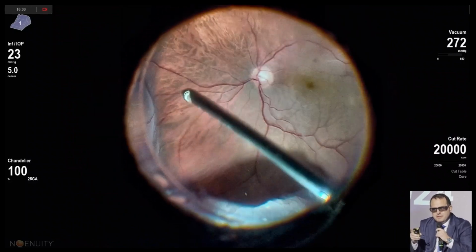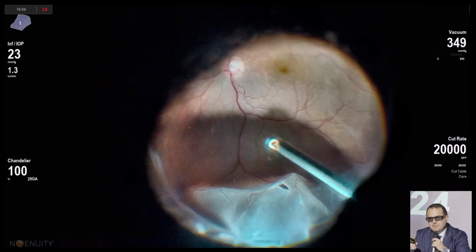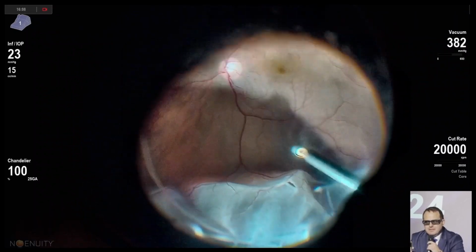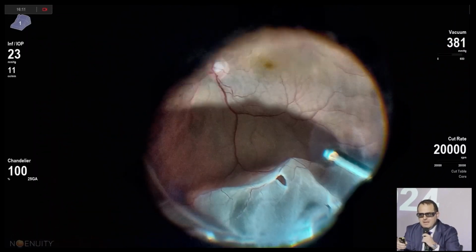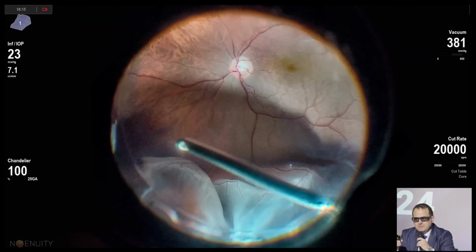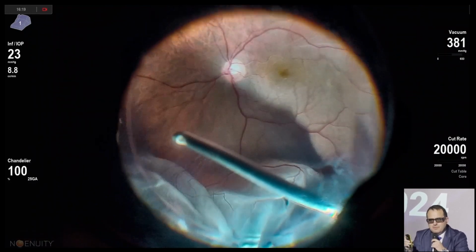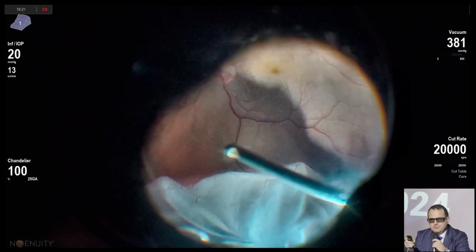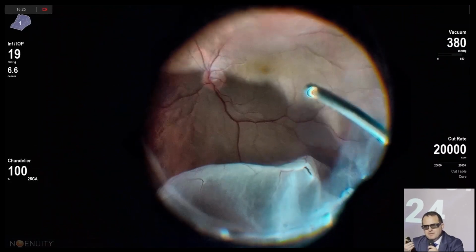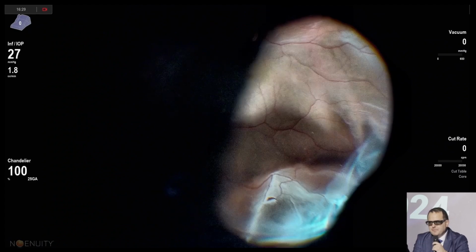You can appreciate also the look of the retina. It is not natural, but we have a lot of contrast. So the digital filters are actually enhancing our tissue perception. See, perfectly well the vitreous is highlighted with a regular light. So if I see better, I believe I work more precisely and I do a better job.